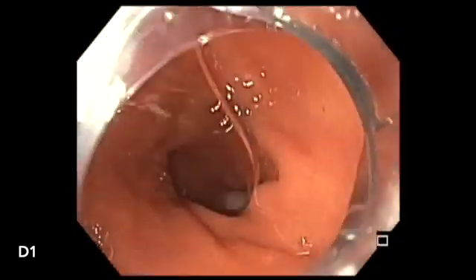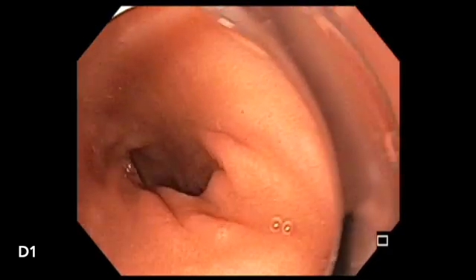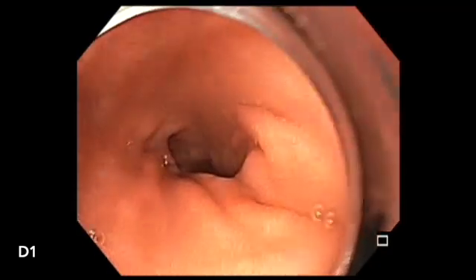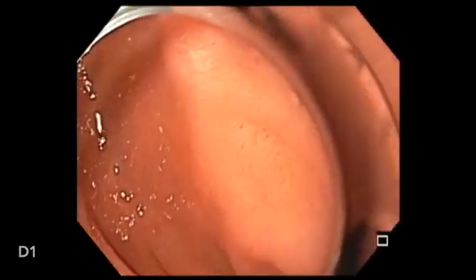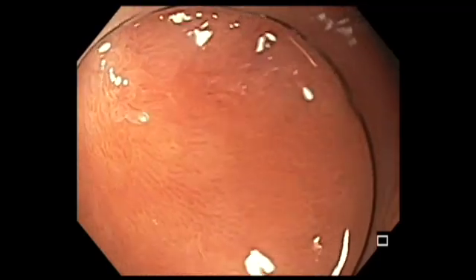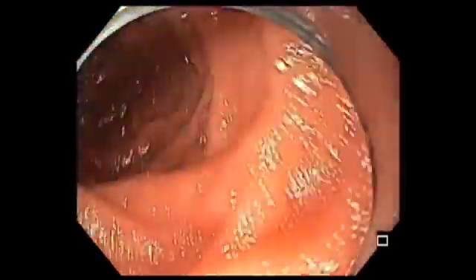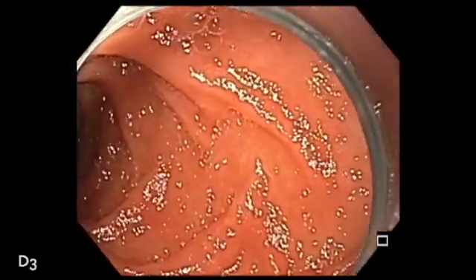As you push your scope in and turn to the right and down, and pulling the scope back a little bit, it will enter into the second portion of the duodenum, and then slip into the third portion quickly.